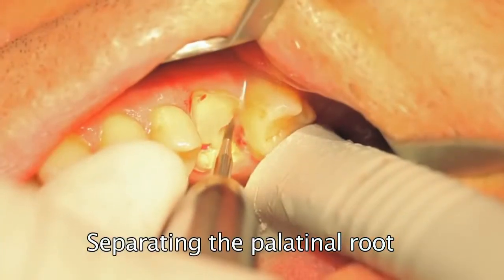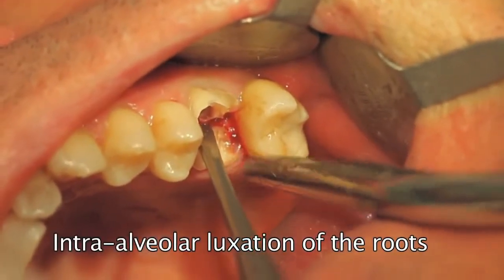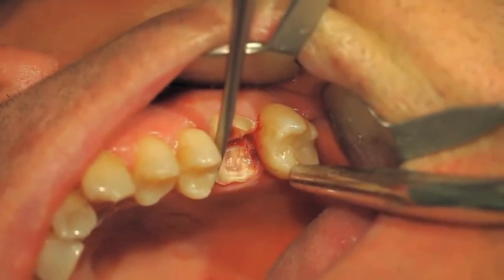The palatinal root is separated from the buccal roots. The luxator is used to make sure the palatinal root is completely separated and to loosen the root thoroughly in a mesiodistal direction.